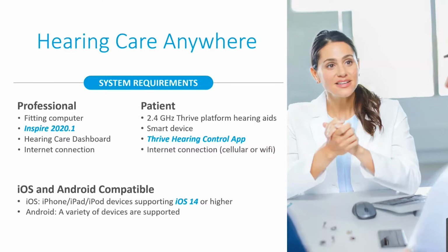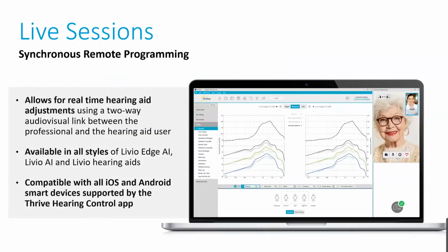on their mobile phone. Now, the great thing about live sessions is it allows the professional to make remote hearing aid programming adjustments in real time using a two-way audio-visual link between yourself as the clinician and the hearing aid user, thus a real-time approach to remote programming.